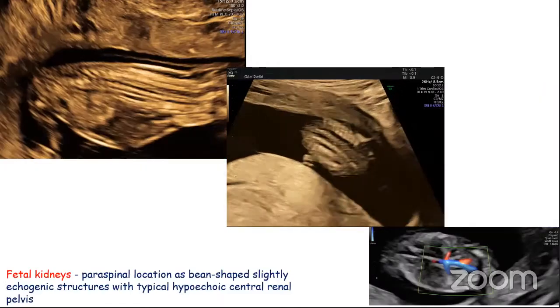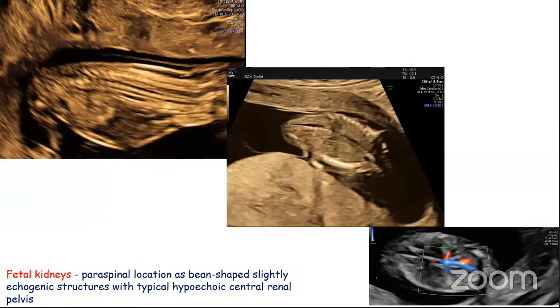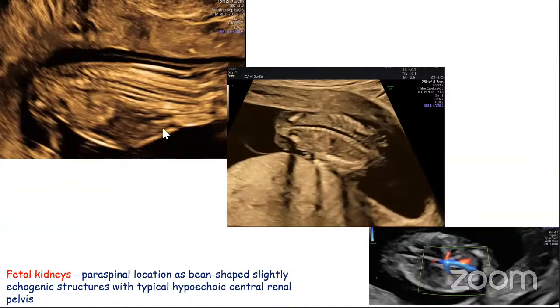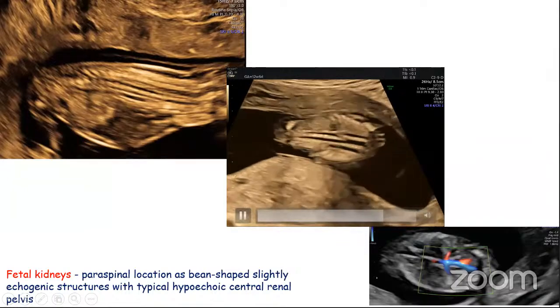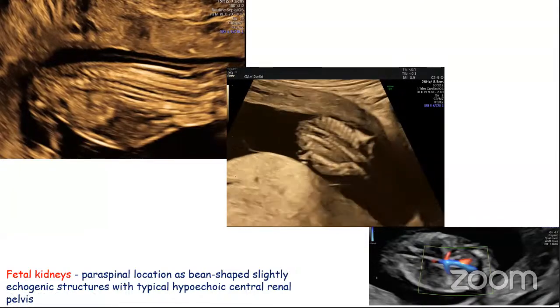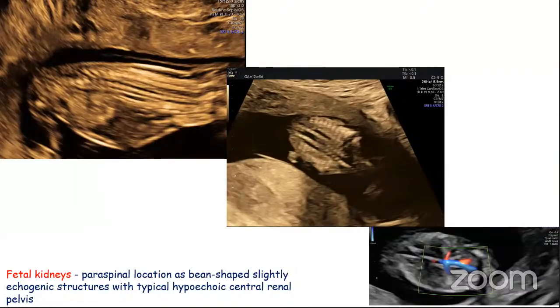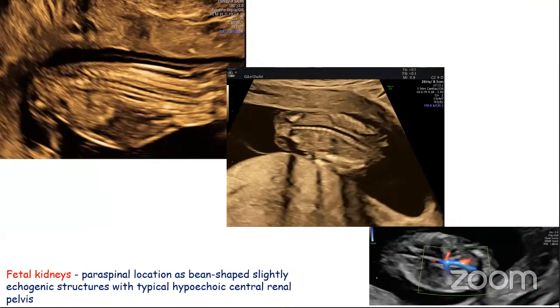To see the fetal spine, we have to wait for the fetus to jump and to turn in a prone position. We see the fetal spine in a longitudinal and coronal views. What we have to note is the normal vertebral alignment and integrity and intact overlying skin, and particular attention to the normal appearance of spine has to be given when BPD is less than 5th centile.